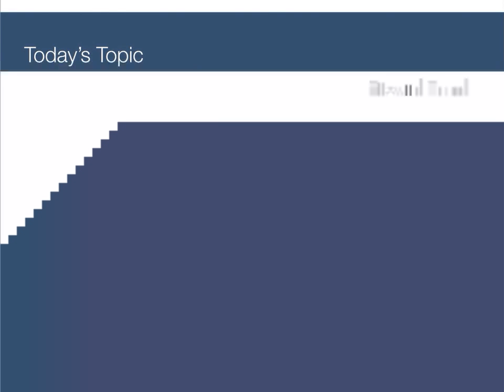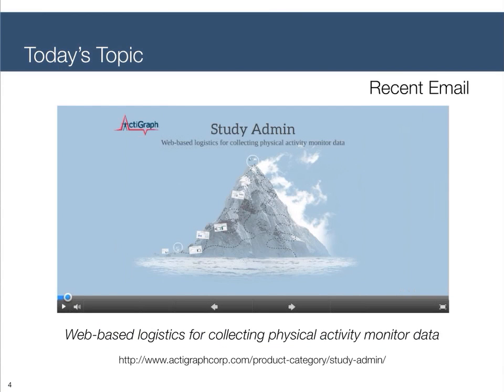Recently, last week, we provided an email to our users, and that email contained a link to a presentation similar to the one that I'm showing on this slide. The title of that presentation was Web-Based Logistics for Collecting Physical Activity Monitor Data. That particular presentation is very helpful in providing some context and background and really review material for what I'm going to cover today. And so that web link is available here. You can go to that URL and you will see that presentation link.